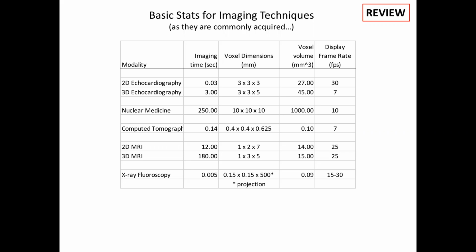A little bit, you might see sometimes when you play things fast, it's almost like another dimension pops open, like you go farther into a depth perception when the frame rate goes up, which is kind of interesting. But 30 frames a second is usually enough for a human.